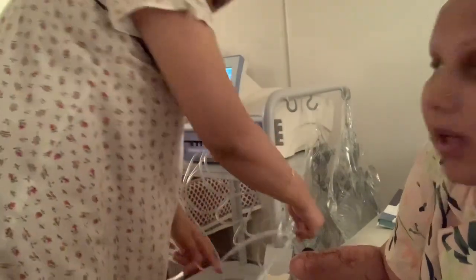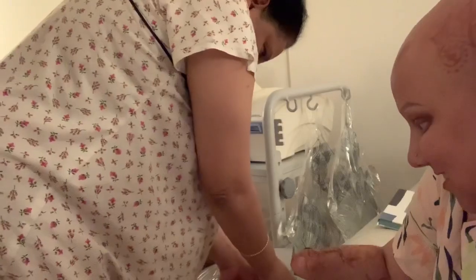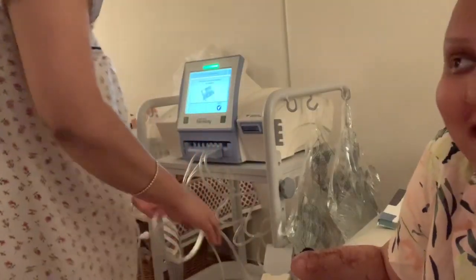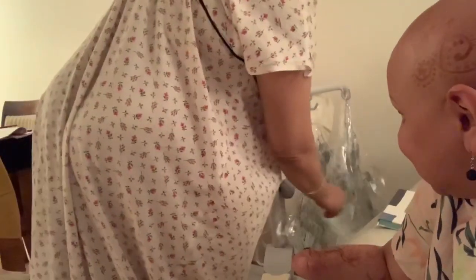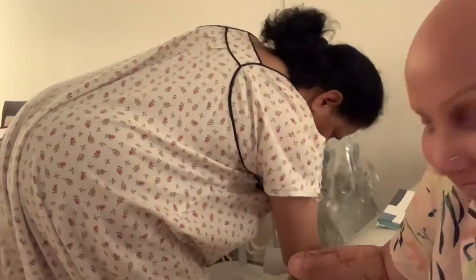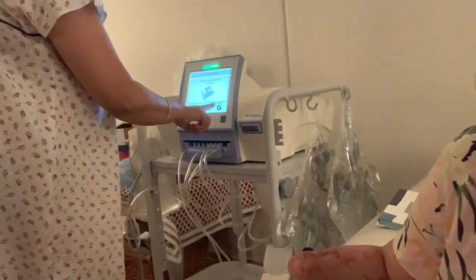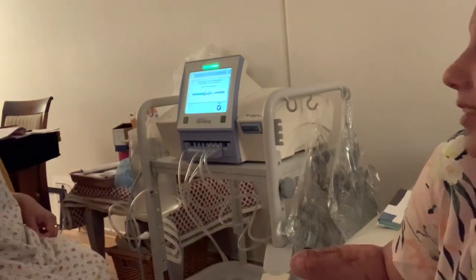I still don't know how to use the second connection, so I'm basically stuck to my bed. I can't detach from the machine — though we could take the whole machine with us; we did that once. The drainage bags will be emptied tomorrow morning into the toilet.